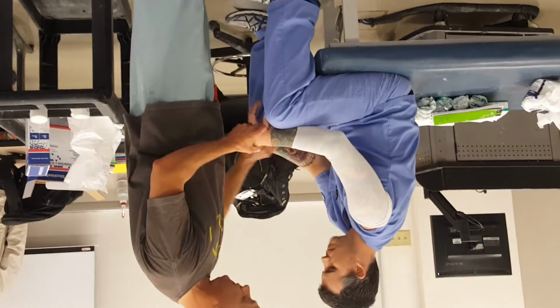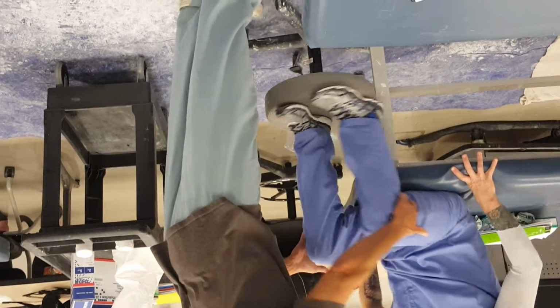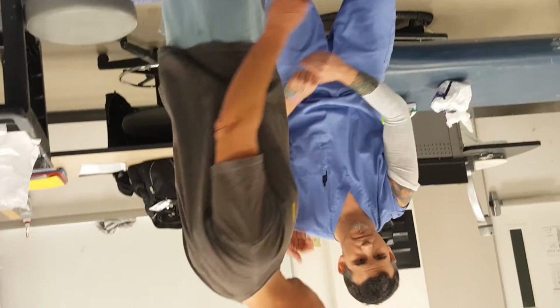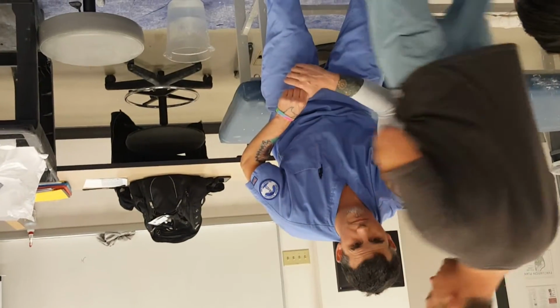So in real life, or your shoulder quiz, sorry, you're going to scoot face down. Put your butt on the edge. There. Butt off. Good. So, same as a coaptation splint. How do you position the patient for that? They're holding their thumb. Exactly. That's what they're going to do. You want gravity here.